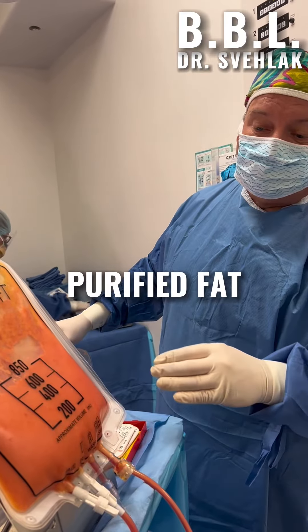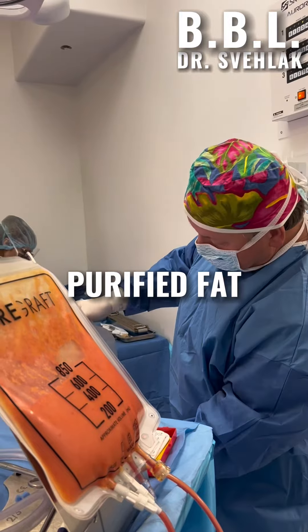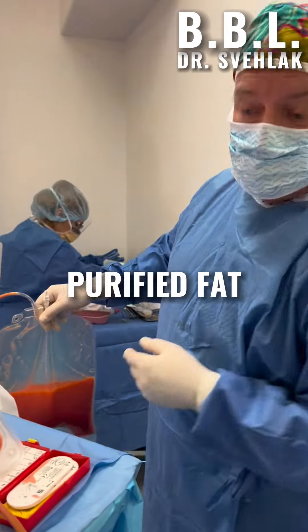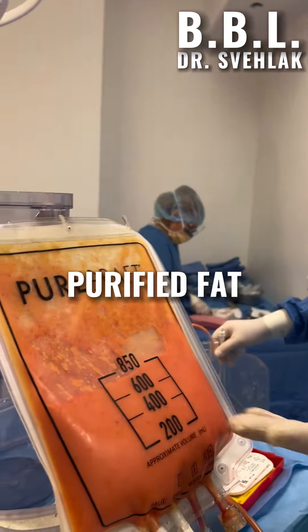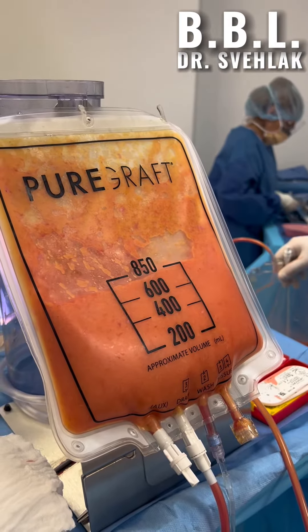Here's our purified fat. Second wash, and all the waste water is going into this waste bag. You can see the fat is much more yellow, less of the blood, less oils in there. So now we have really good quality fat for grafting.